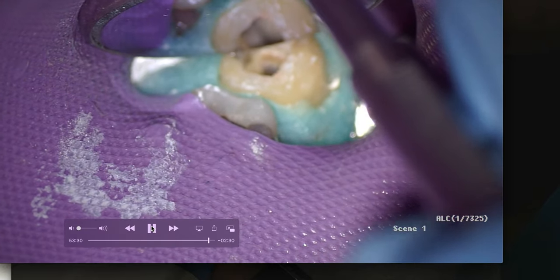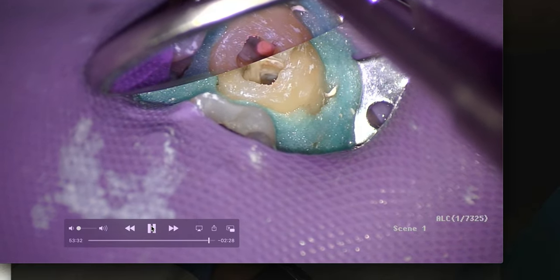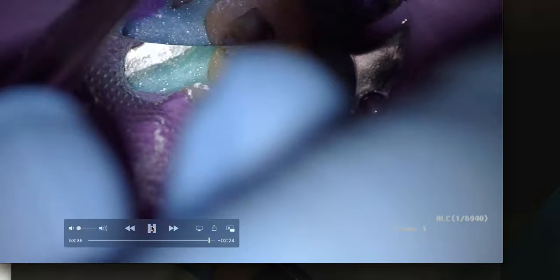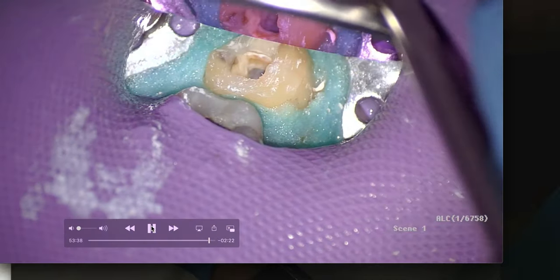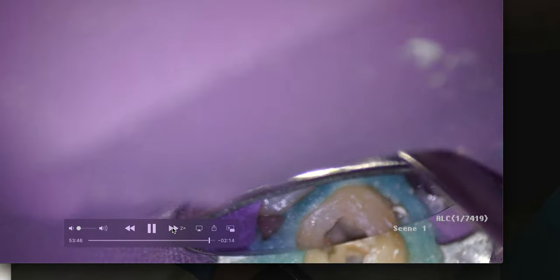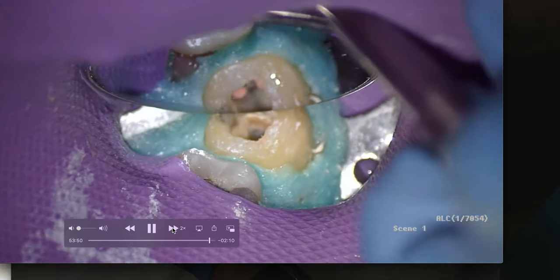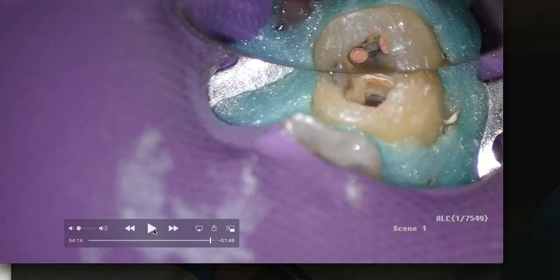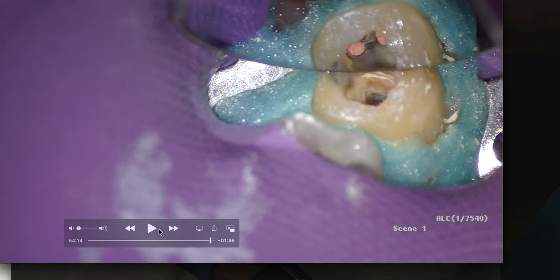Zooming in — there's our distal canal and there are our two mesials. We're good. Because we're putting a temporary crown back on, I place a cotton pellet, then a thin layer of Cavit — a dental assistant taught me to mold it into a little cone, put it on the instrument, and just place it down. Simple. Take the rubber dam off, put the crown back on, and that's it.